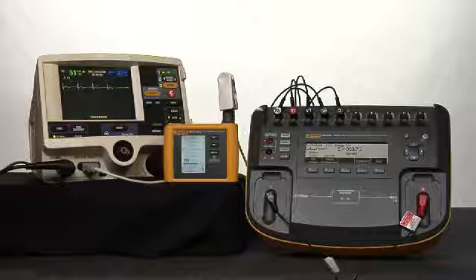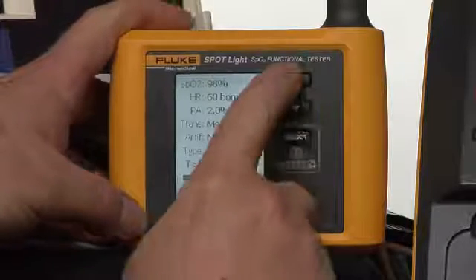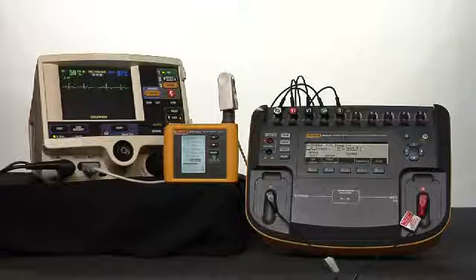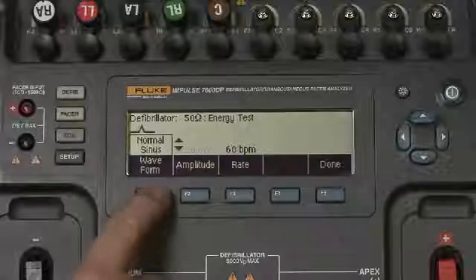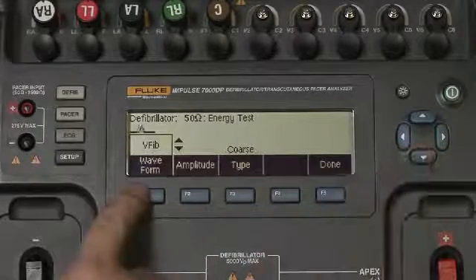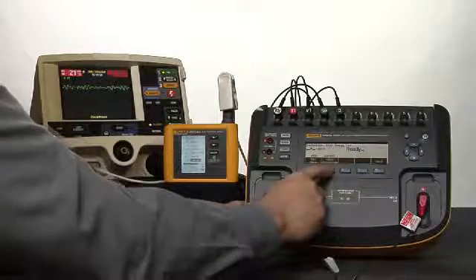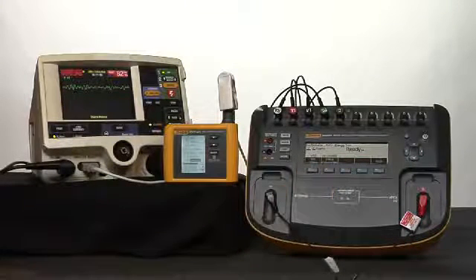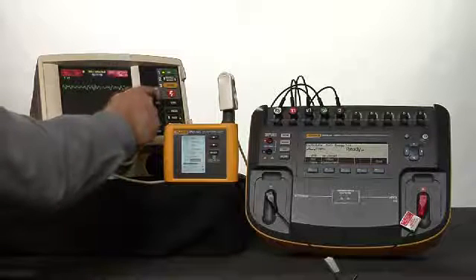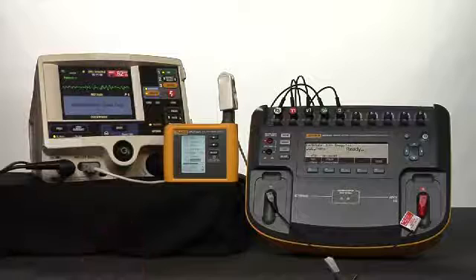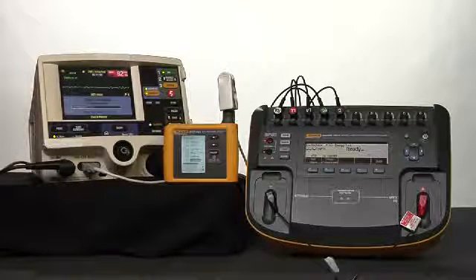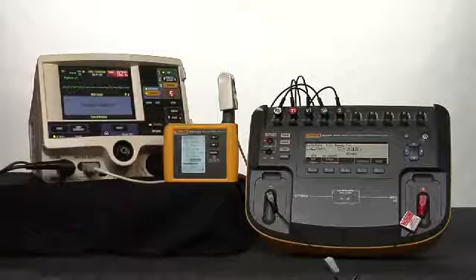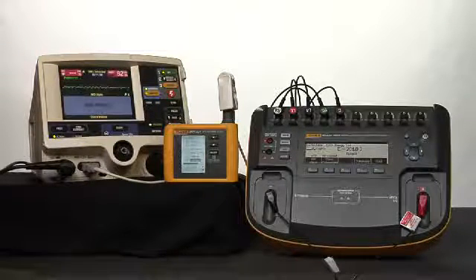At this point we want to change our ProSim Spotlight to Custom Setting 3 for Hypertension. Custom Setting 3 selected. Also set the wave on the Impulse 7000 to V-Fib and the Convert to No Convert. To test the AED functionality, press Analyze on the device under test. Pressing the AED mode Analyze button. Stand clear. Push to shock. Discharging. 201.0 joules measured. No conversion.